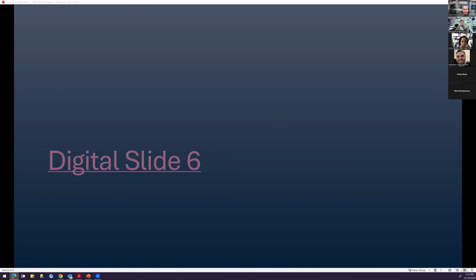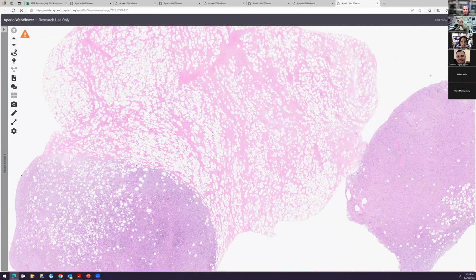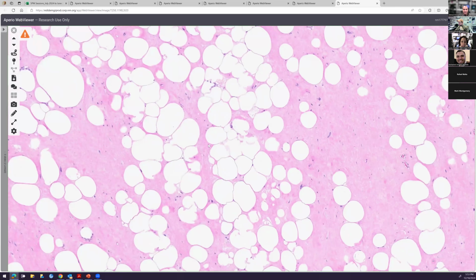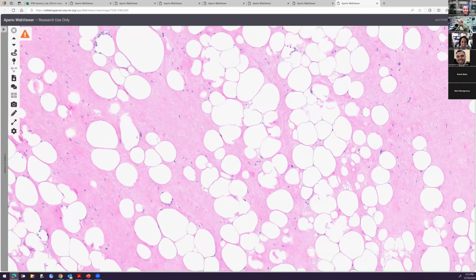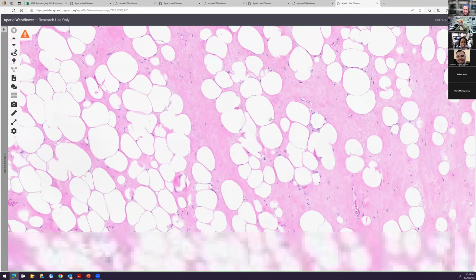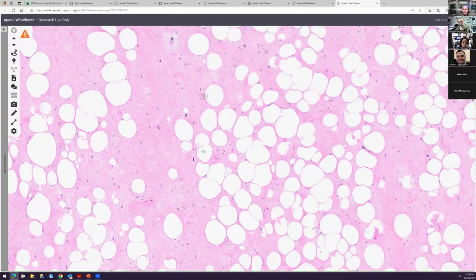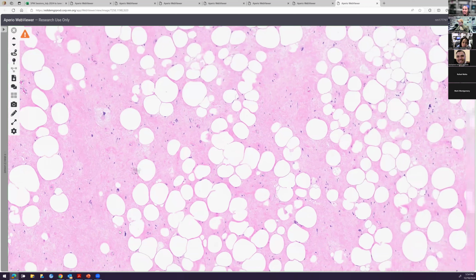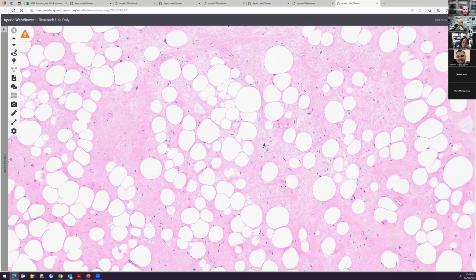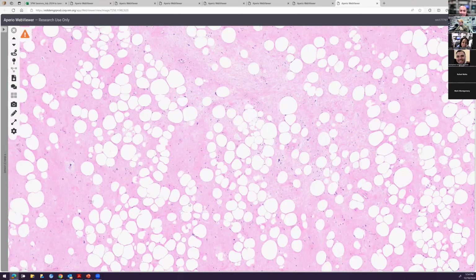All right, what is this one? Okay, let's start over here with this one. So what are we looking at here? I don't like what I'm seeing. So it seems like we do have an adipocytic lesion. I see some scattered atypical hyperchromatic cells. I just saw one. Yeah, they're not that big though. They're not huge, but as we go around, we might see a few more. Maybe that guy, maybe this guy. I see a couple, and then over here. I think that's enough for me for well-diff, ALT versus well-diff, depending on location. What is going on here?